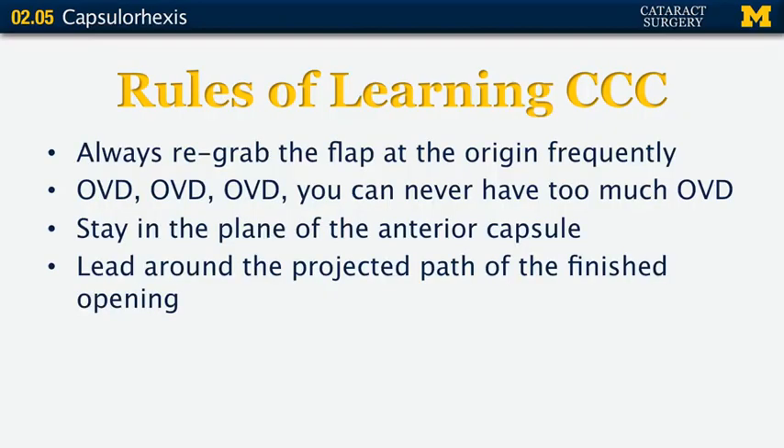The basic rules of learning how to do a capsulorhexis: always re-grab the flap at the origin frequently. Don't wait until you've got a lot of capsule torn before going back to the origin and re-grabbing, because that gives the tear a chance to propagate out into the periphery, which is not a fun experience.